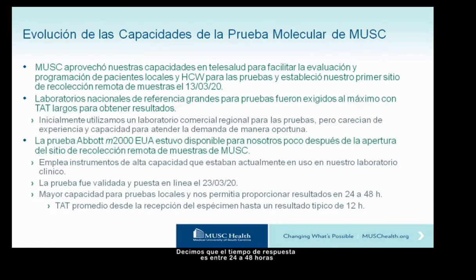We say our turnaround time is in the 24 to 48 hour window, but in reality, the average turnaround time for specimen receipt to result is typically 12 hours for us.